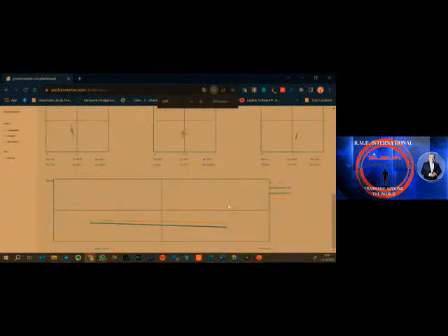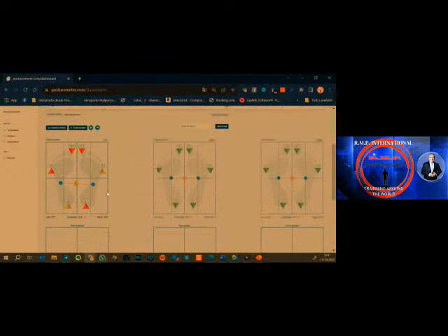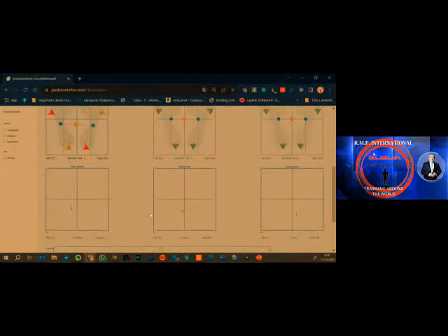You can see which exam is creating torsion, right? If you clear that, you can say, okay, I want to see 1 exam. I click here, and we see only 1 body center, central body center, foot support, and torsion.